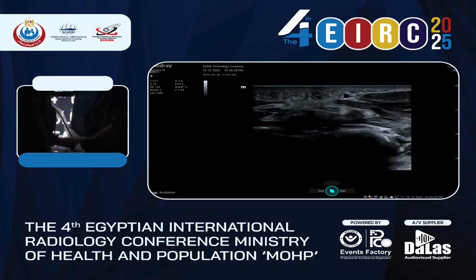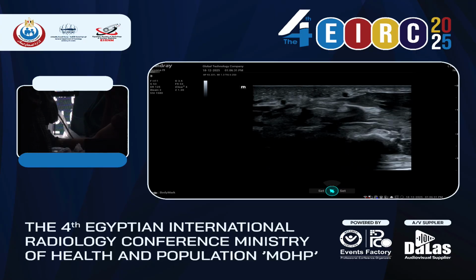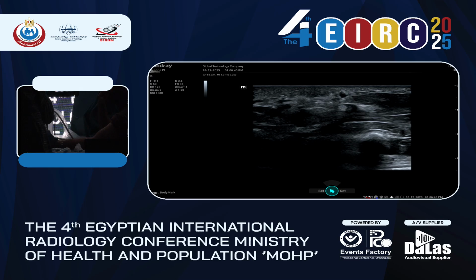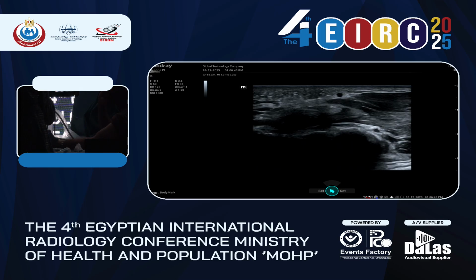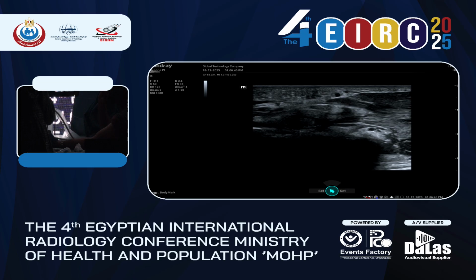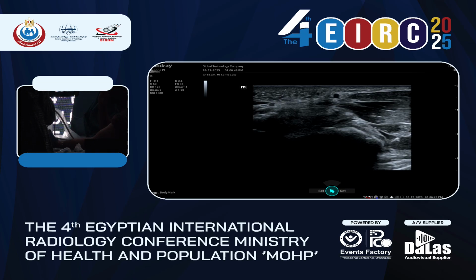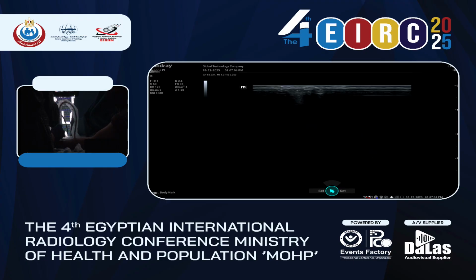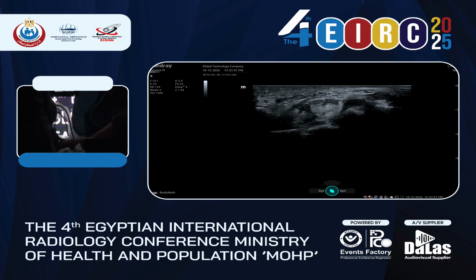And this nerve, the $1 million nerve or recurrent motor branch, which you can see here, has a lot of variations. Sometimes it goes transligamentally, so it goes through the transverse ligament at a more proximal level than its origin. So that's why we need to point it out in our report. If we scan to help the surgeon, we need to point out in our report 3 things. Where is the nerve impinged? At what level? Is it impinged throughout the carpal tunnel or only at the entrance? Because it is very important for the surgeon.